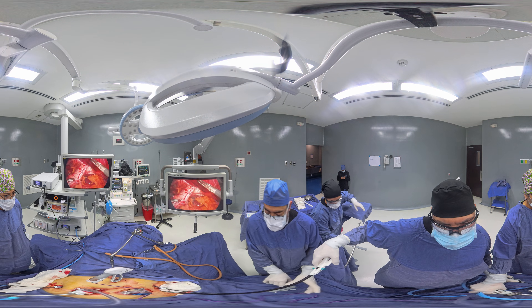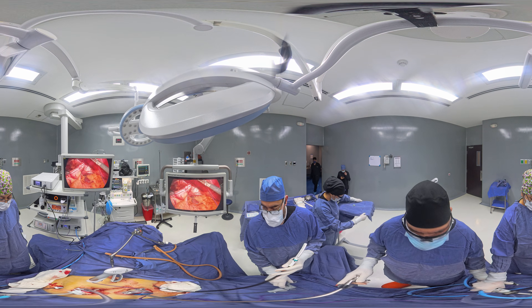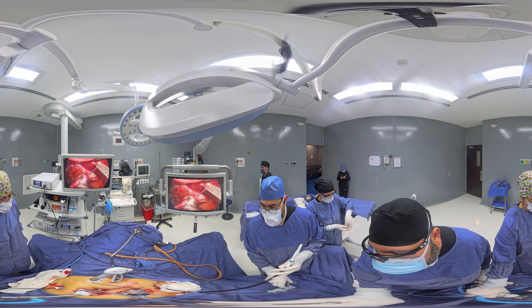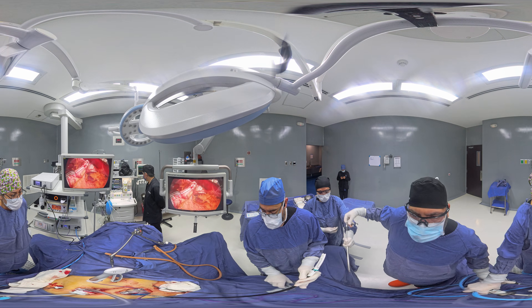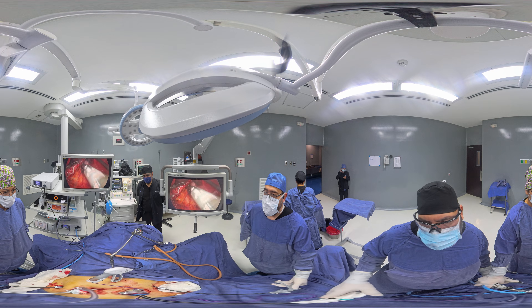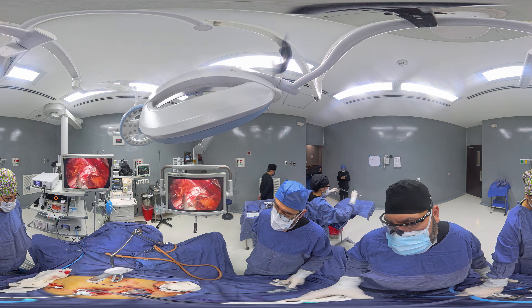Sometimes we see vessels here because the needle is going side by side and the stomach has a lot of vessels. So just to be on the safe side, we place a clip there to create some compression, avoid any bleeding, and we continue ourselves down.